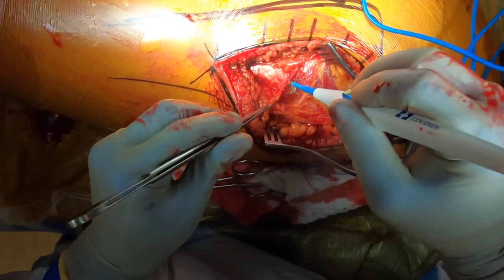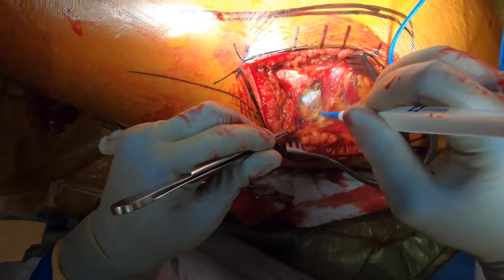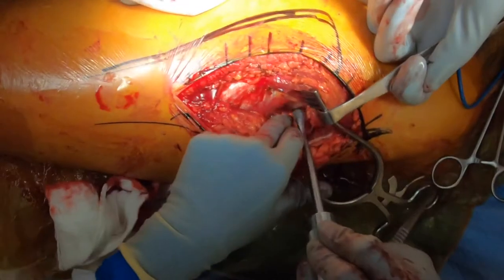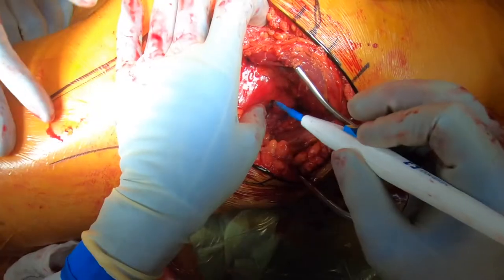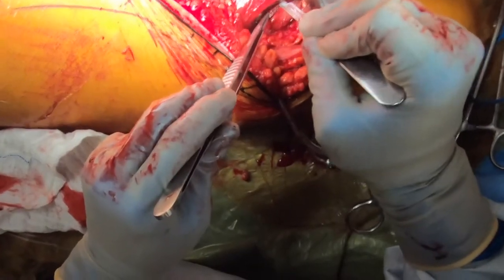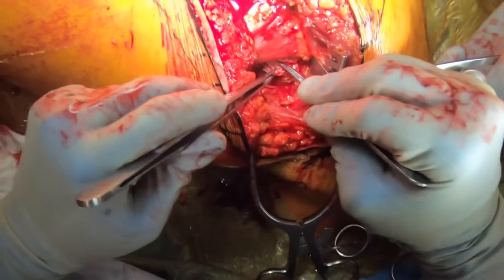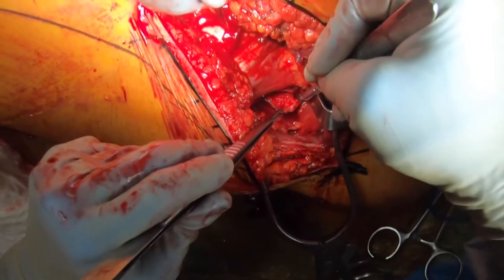The leading edge of the gluteus medius can be seen and the bursa surrounding this is then dissected. The gluteus medius is then elevated with use of an army-navy retractor and the capsule is then isolated. An L-shaped capsulotomy is then performed along the intertrochanteric ridge first with use of a scalpel, along with a cranial limb in axis with the femoral neck.